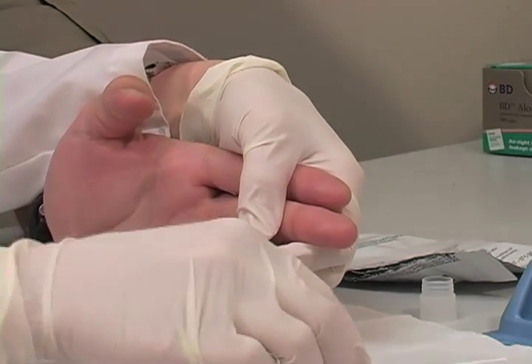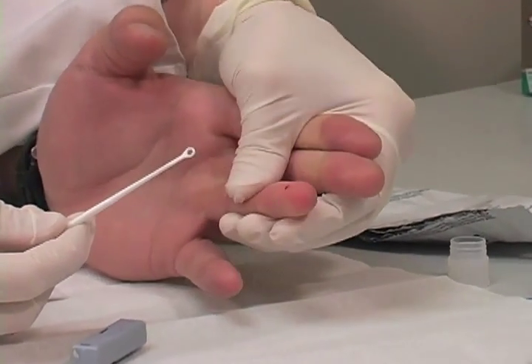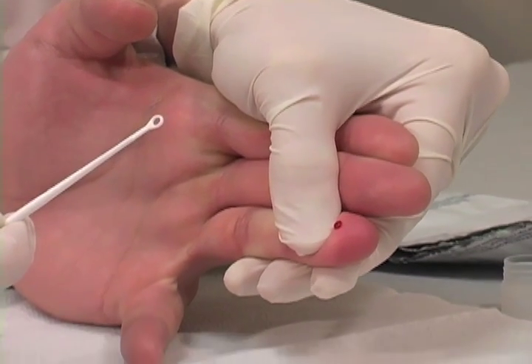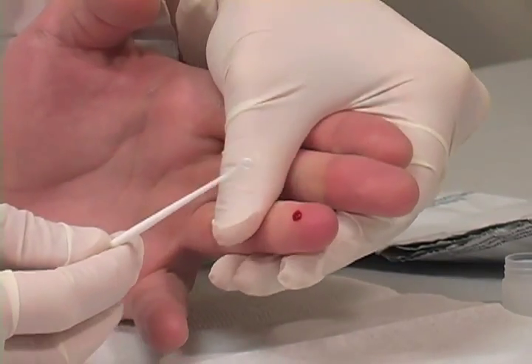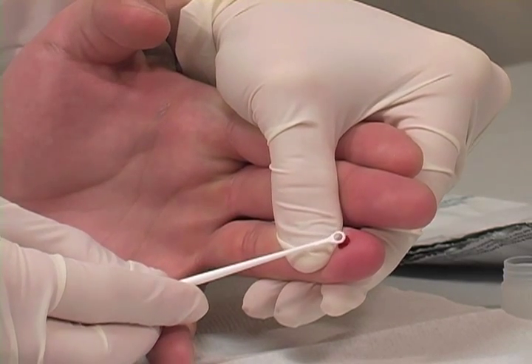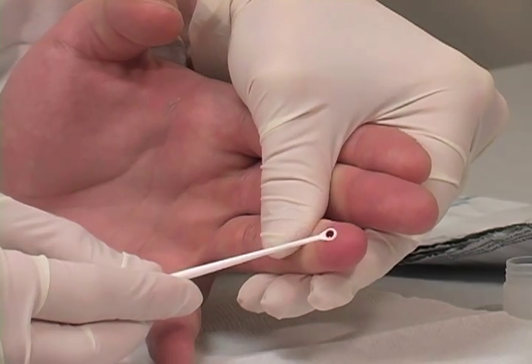Pick up an unused specimen collection loop by the thick handle end. Put the rounded end of the loop on the drop of blood. Make sure the loop is completely filled with blood. If the loop is dropped or comes in contact with any other surface, discard it into a biohazard waste container. Get a new loop for the collection of the blood sample.